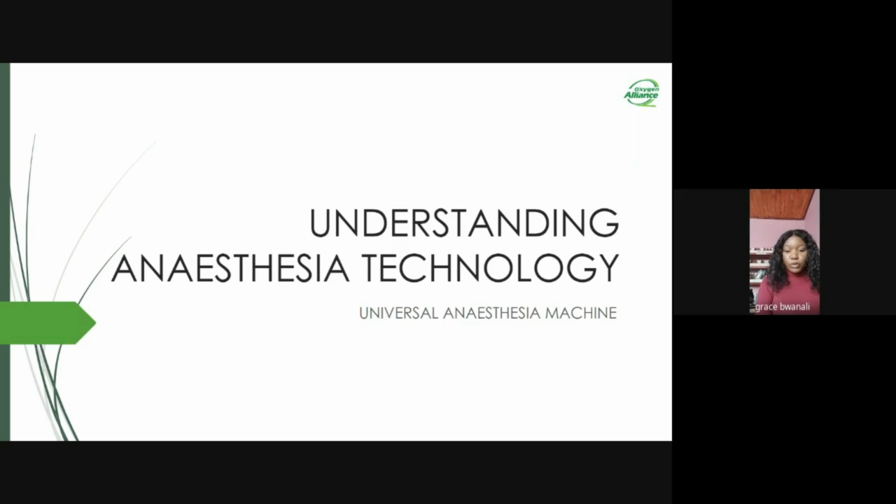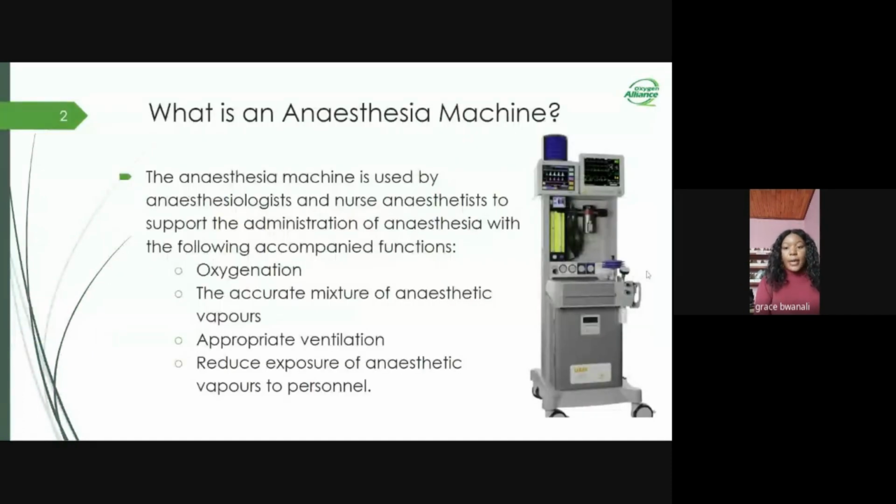This device is equipped with two modes. The Universal Anesthesia Machine is equipped with the draw-over mode as well as the pressure system mode. The draw-over mode uses ambient air as a carrier gas for anesthetic agent, while the pressure system mode uses the oxygen supplied by the integrated oxygen concentrator or an external oxygen source such as pipelines and cylinders. So, as you can hear, we have the oxygen concentrator integrated in this system, but pipelines and cylinders can also be used to supplement gases.